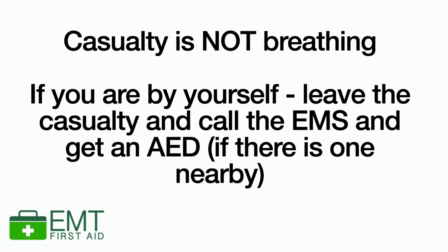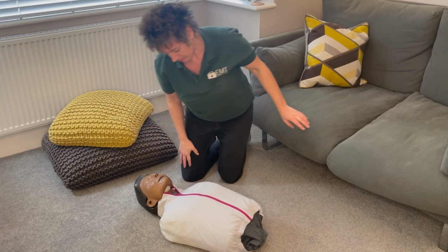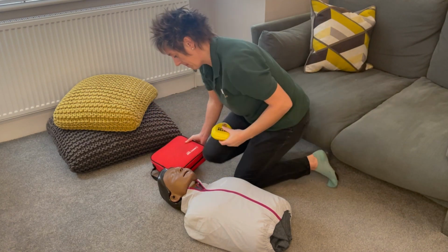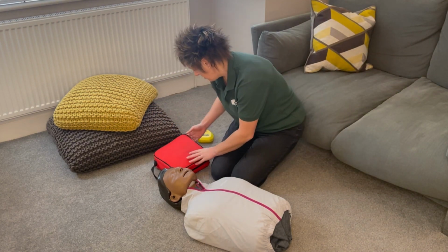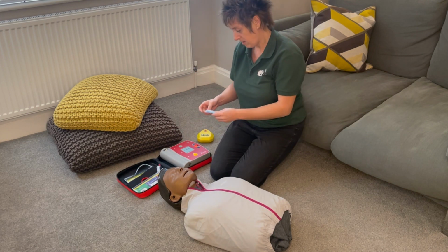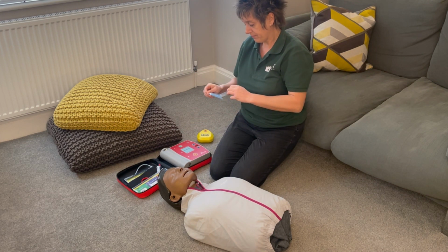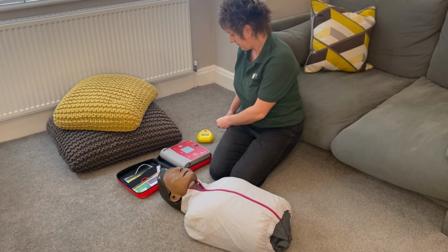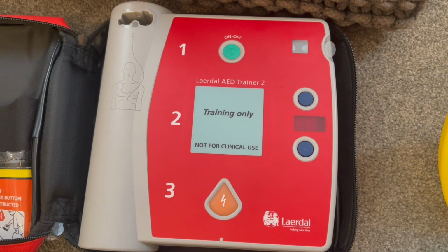So I leave the casualty now and I go and call the emergency medical services, and I make sure I grab the AED because there's one easily located that I can get in a few minutes. I return with the AED. The first thing I do is open it up and turn it on because it's going to talk to me. It's going to tell me exactly what to do. I'm then going to make sure I'm wearing the correct PPE. So I'm going to get my gloves on in this case. I'm then going to follow the instructions.